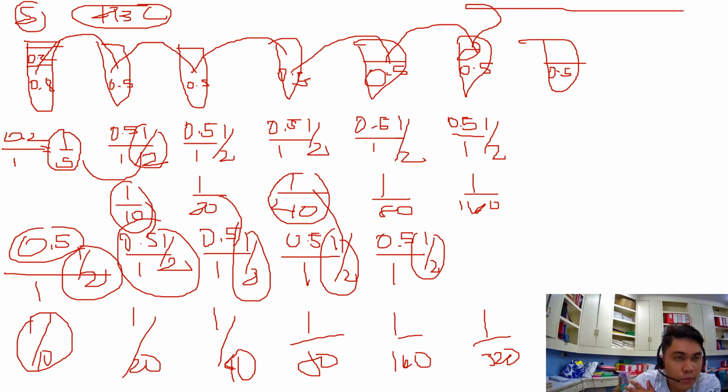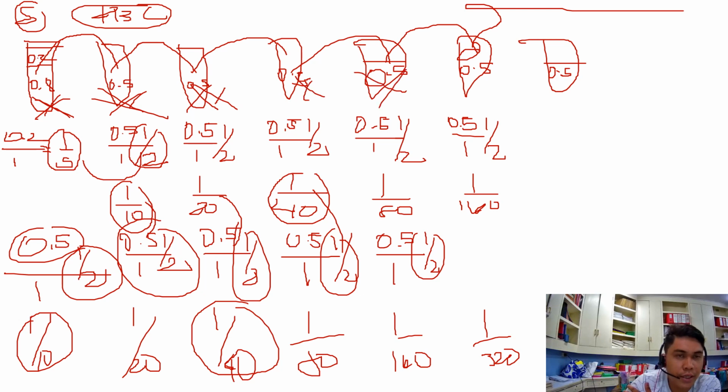The tube with the highest dilution showing agglutination, that's the titer. So for example, agglutination, agglutination, agglutination, the titer is 1 is to 40. If the result is agglutination in five tubes, then the titer is 160. So that's for your cold agglutinin test.